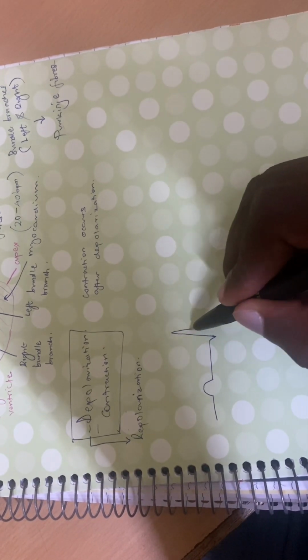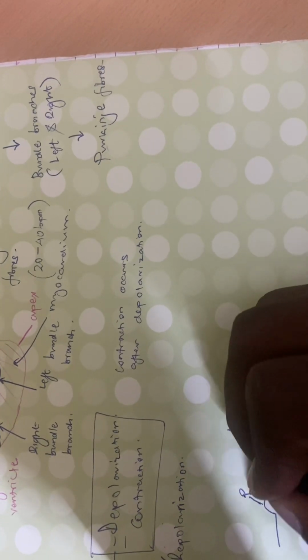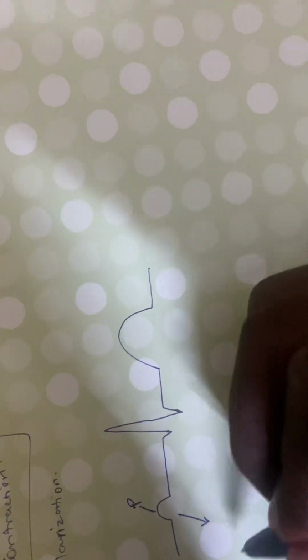This is the ECG. P, Q, R, S, T. This is a normal ECG we can see. So on the ECG, which wave represents which? We have said impulses generated from the SA node spread through the atria first. The atria depolarize. So if the atria depolarize first, then the P wave, this is P, is going to be for atrial depolarization.